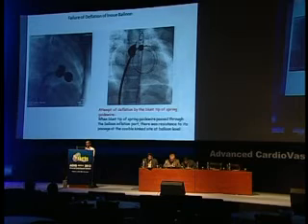This is another case example where the authors tried to pull the catheter. They could pull it from the mitral annulus to the LA, and then they advanced the blunt tip of the LA wire through the inflation port, could perforate the balloon and then deflate. So these are some of the important complications.